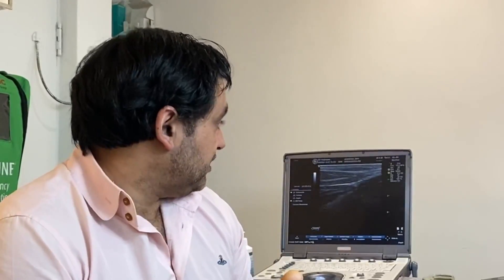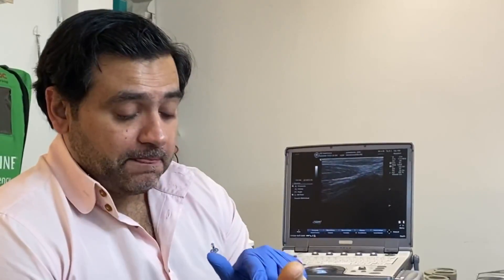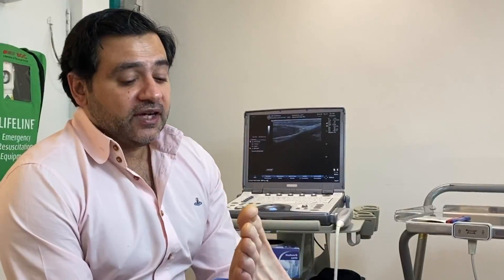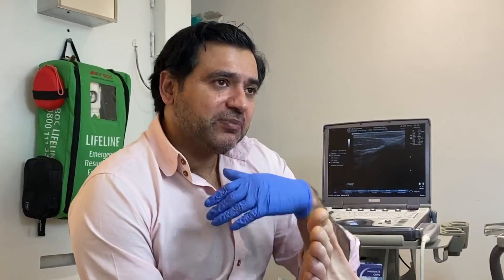What we're going to do today is a Kenalog injection under a patient-specific directive into the medial band of the fascia, into the plantar fibroma. There are alternatives: we've done a series of shockwave treatments, radiotherapy is another option though there are only one or two papers written on it, collagenase is also a treatment option, and surgery — though surgery is probably one of the last options because the recurrence rate is very high.